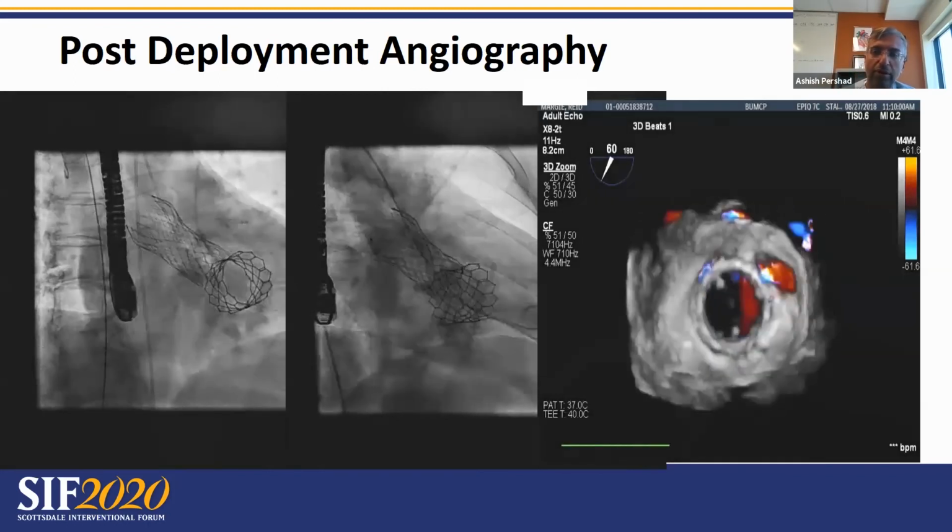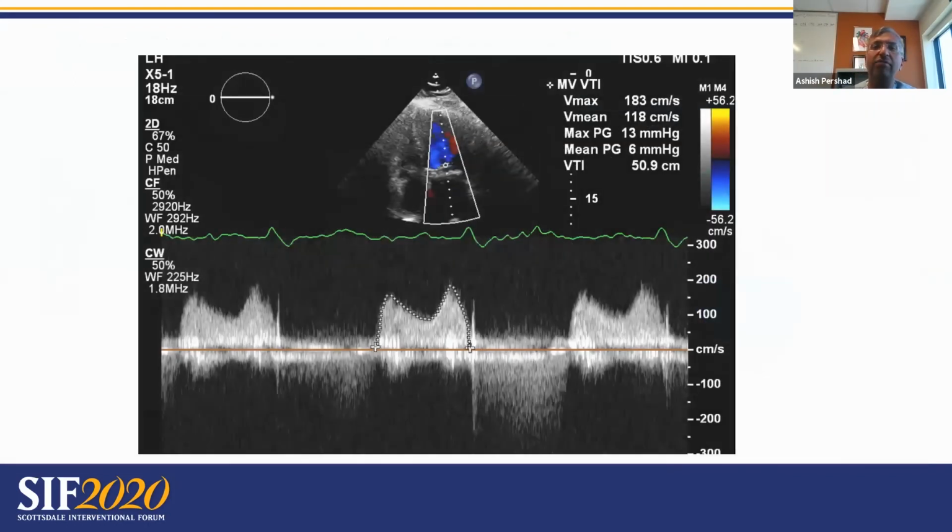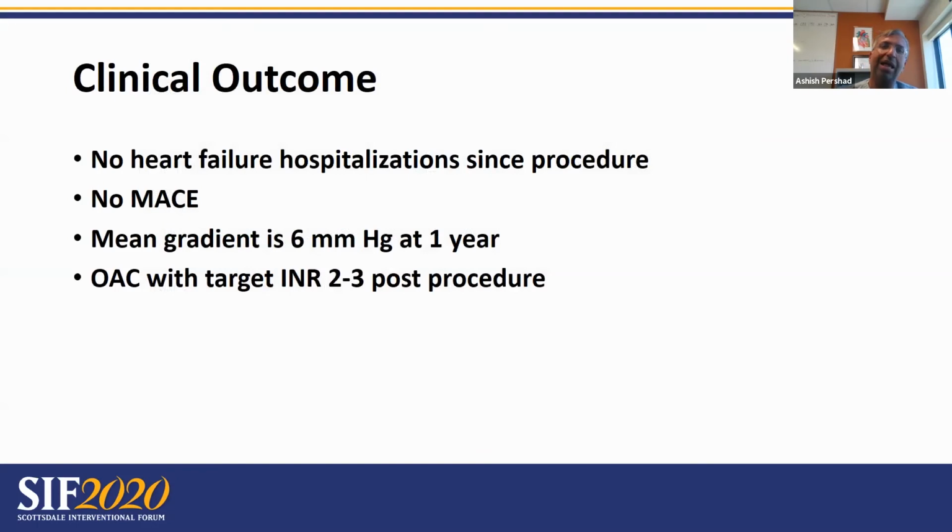We then checked the gradient across the valve, and the gradient had now been reduced from 14 to 6 millimeters under what were thought to be baseline loading conditions, and which was thought to be an adequate result. Her clinical outcome was excellent.